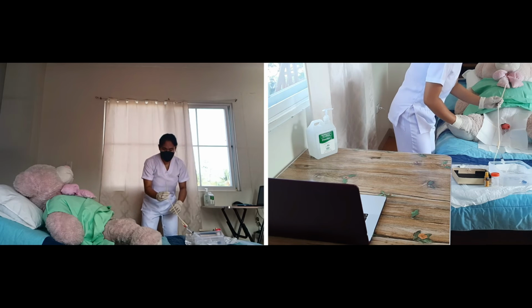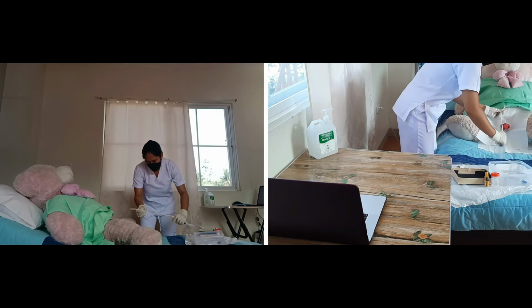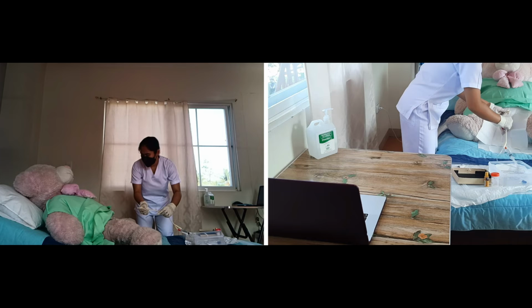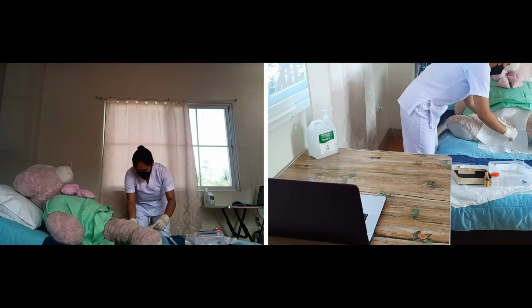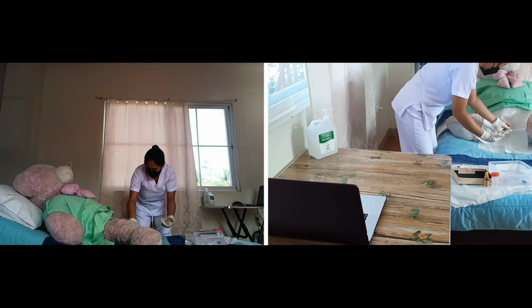So I'm going to insert this until I can see urine and go about 2 more inches. Okay? Mr. Park, can you take some deep breaths for me? Okay. I'm going to be inserting. Okay, I can see urine now. Let's go 2 more inches. Okay, you're doing great, Mr. Park. I'm going to insert the water.